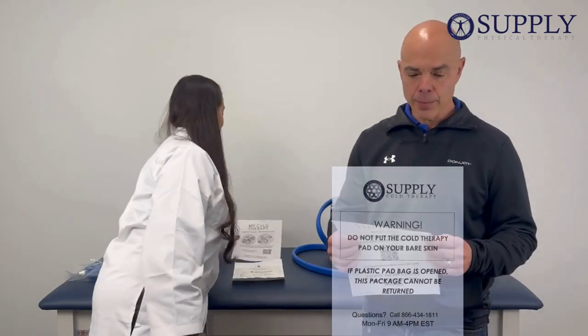The other thing you're going to get in the bag or the box is the skin warning label. Never put the pad directly on your skin. The universal protocol for ice is 20 minutes on and 20 minutes off. Please check with your physician to make sure you're doing what he or she is asking you to do.